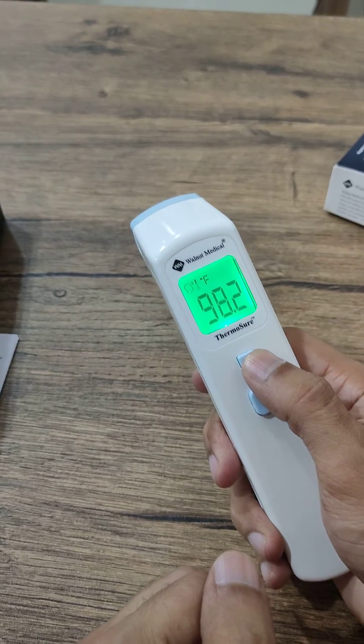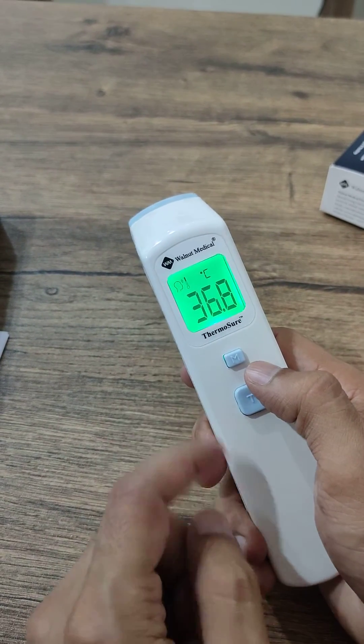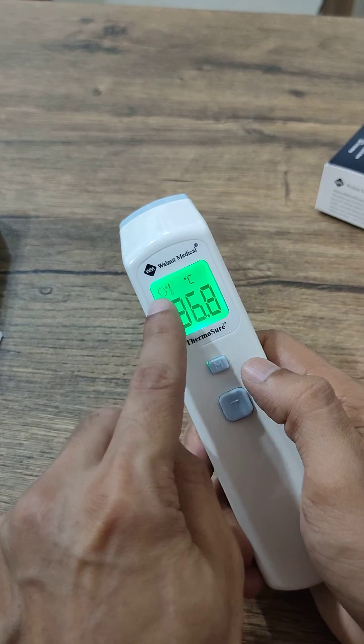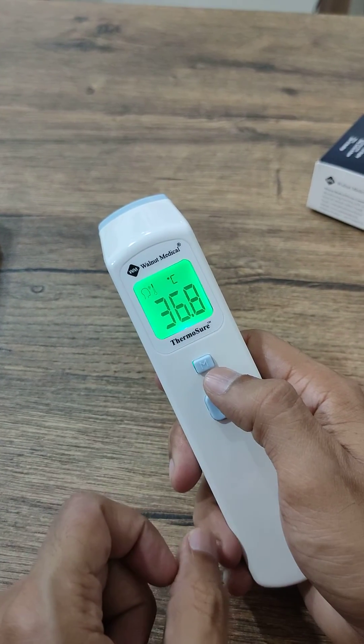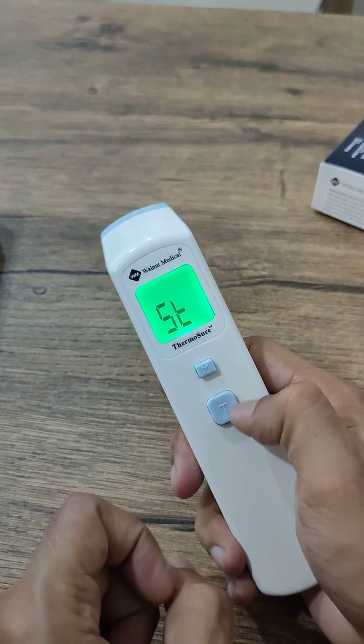If I want to see the reading in Celsius, I press mode once — this is now in Celsius. You can see the skull icon here, and this icon represents the human body temperature mode.